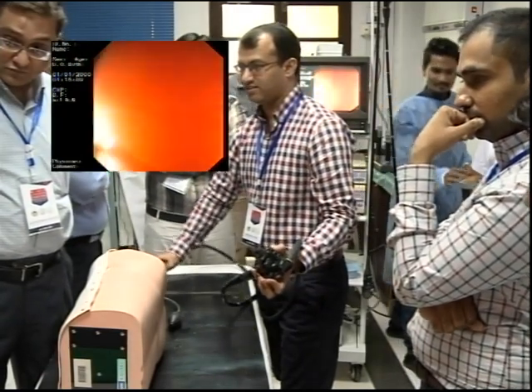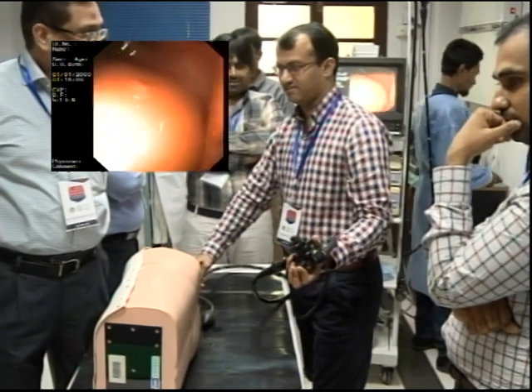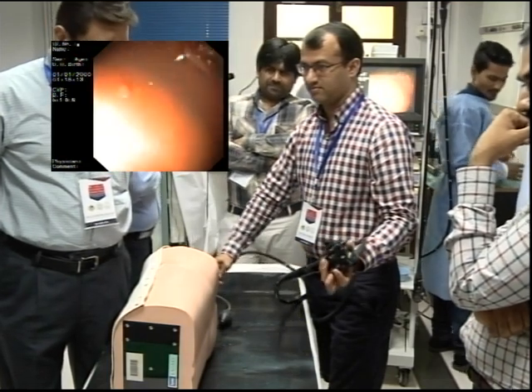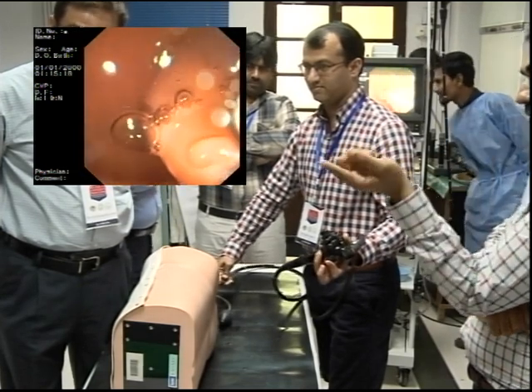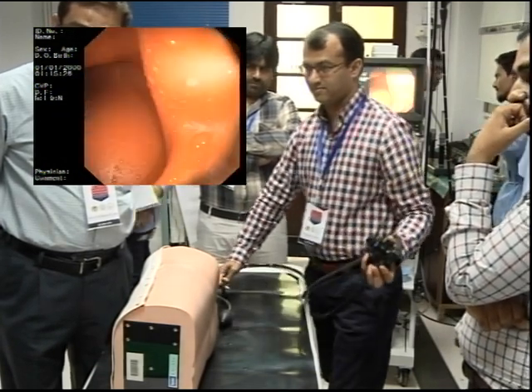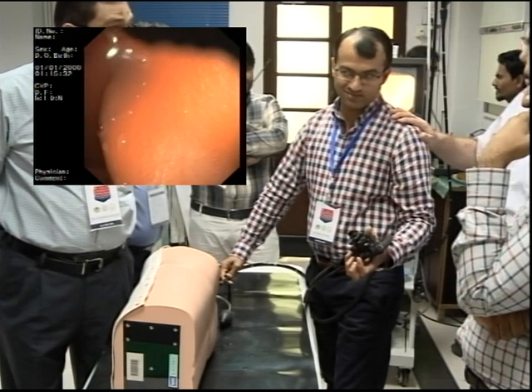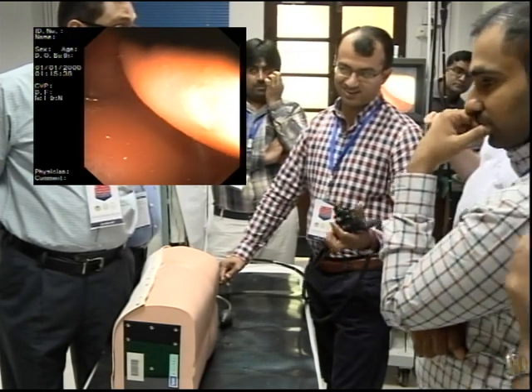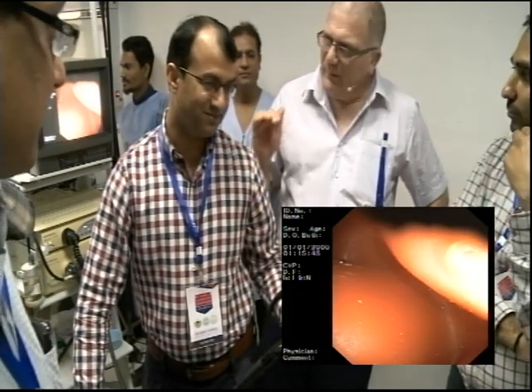Good. More? Good. So where's the liquid telling you? Stop. Where do you think the lumen is? Don't look. Where do you think the lumen is? You think it's somewhere because you obviously keep pushing that direction, and I'm using the word push. So where do you think the lumen is?